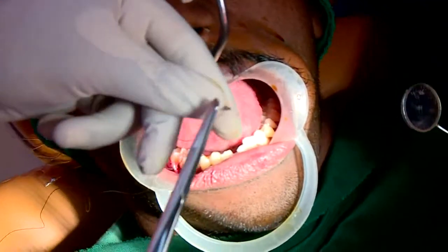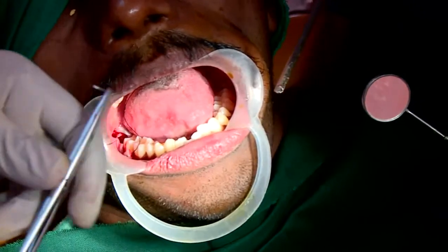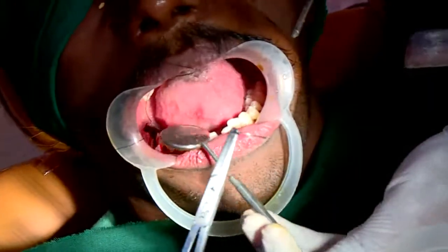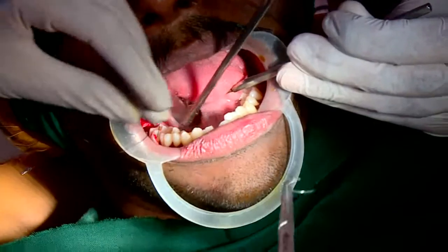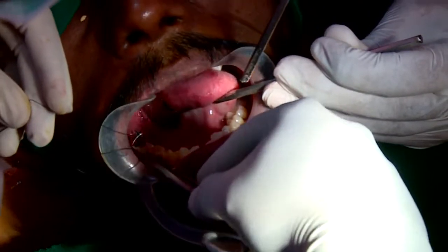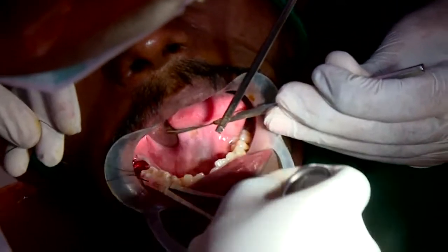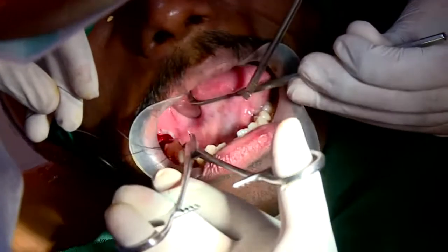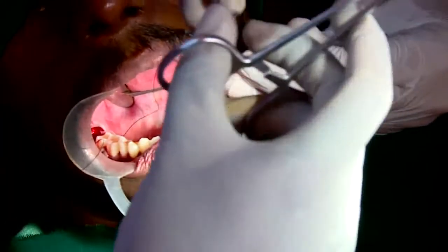Since sir used a modified incision, more number of sutures will be needed. You will have to suture anterior. So sir is suturing the distal here. Sir, first I am suturing the mesial papilla of the 7, just for stability of the flap. Yeah, so like I said, modified one. So it started from the mesial of the region, so it's suturing that segment.